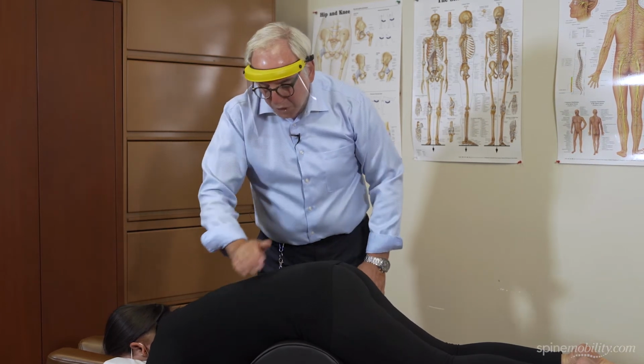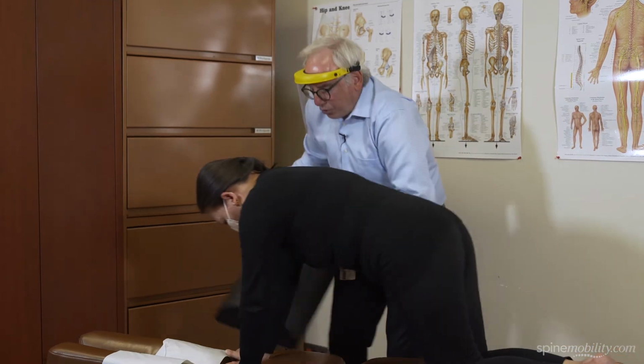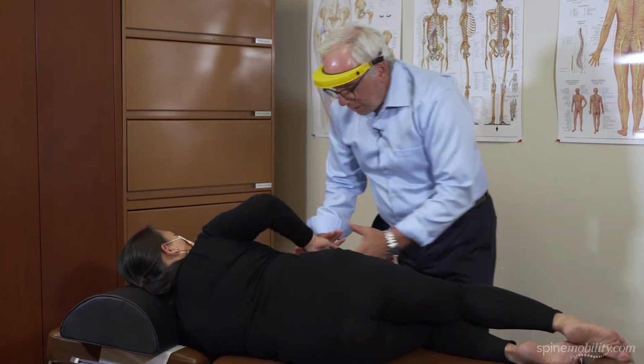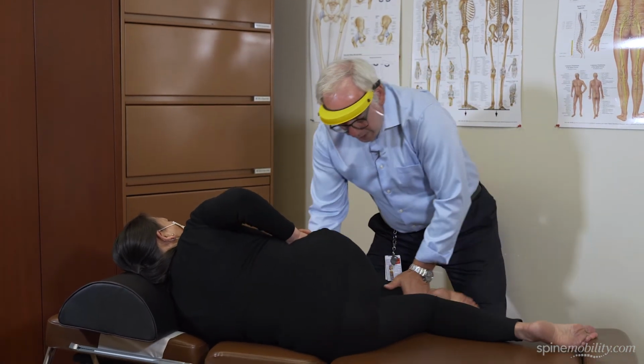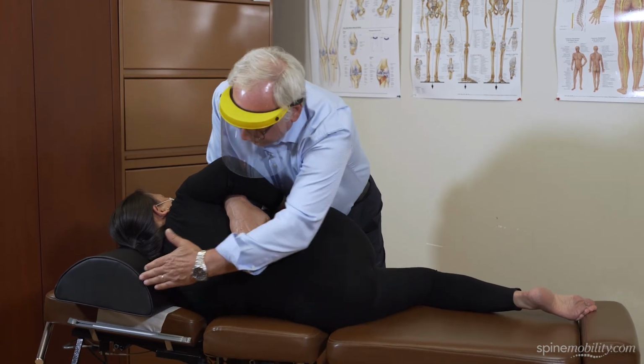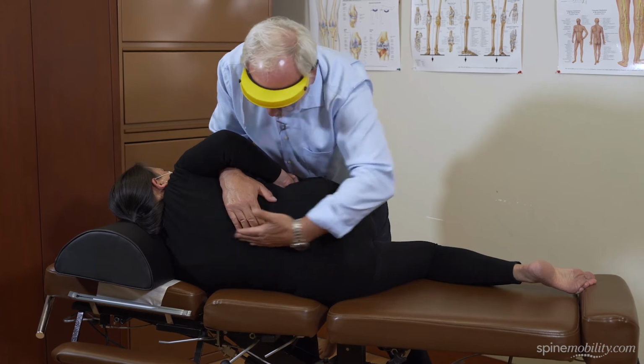The next maneuver where you can use the bolster is when the patient's on her side. We're going to use the bolster to support the head while you're doing the side posture maneuvers, and this side posture maneuver is specifically aimed to introduce intersegmental flexion. The pillow supports the head. The head is aligned with the rest of the spine.